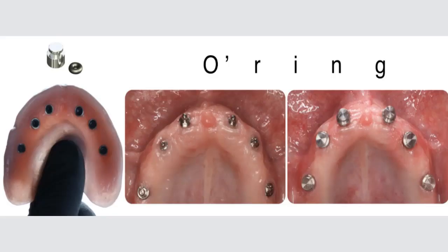Here is the final aspect of the surgery, and here is the complete denture, the one you have seen with the O-rings inside. One can ask, Nelson, why don't you do a hybrid for this patient? Yes, we are doing a hybrid, because the story here did not finish. Why are we doing a hybrid? Because we strongly believe that from a complete denture, the way that I have produced it, I can easily change the same file and make a hybrid. And this is going to be the next story I'm going to be telling all of you very soon.